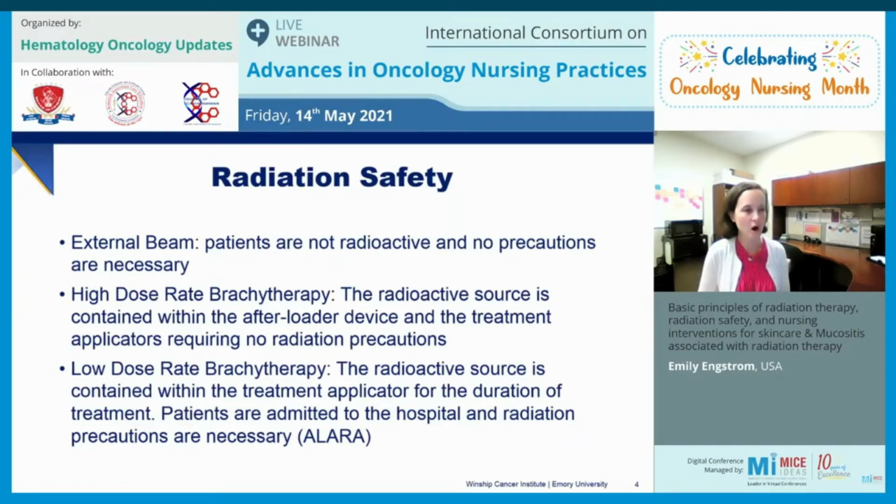And this is a common question from patients. They don't understand how we can give them radiation and then they're not radioactive or they're not carrying around radioactivity. The radioactive beams actually do the damage, and then when the beams are turned off, the radiation's gone. I usually use an example of a light bulb with our patients. When I turn on the light, it's there, and when I turn it off, it's gone. So that helps them understand that process.